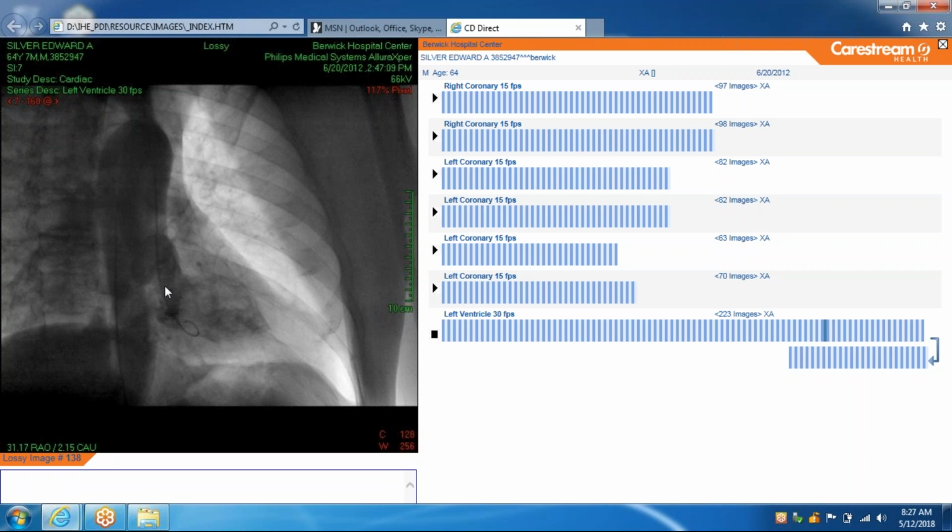So you can see that there's some mitral regurgitation. And you can quantify the mitral regurgitation as well. If you look closely, you can see that there's some contrast material. So you inject the dye, you can see there's a little dye going back. So it's going across the mitral valve into the left atrium. So there's a little bit of mitral regurgitation there.